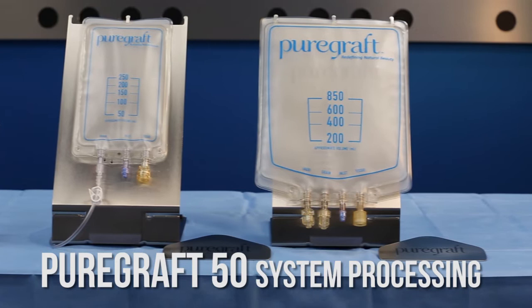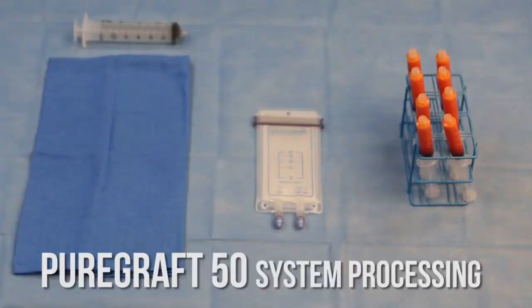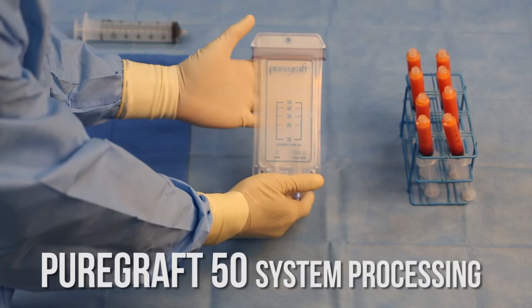The PureGraft system is available in multiple configurations for small, medium, and large volumes. You are about to see an in-service video for the PureGraft 50 system for small volume fat transfer.